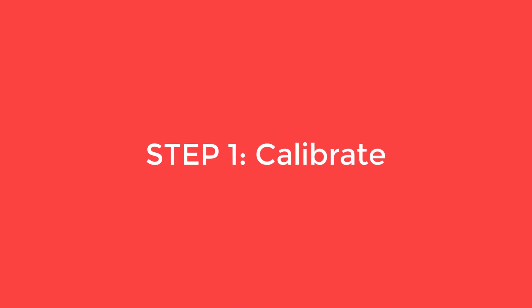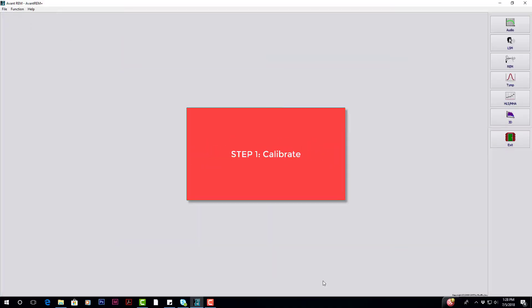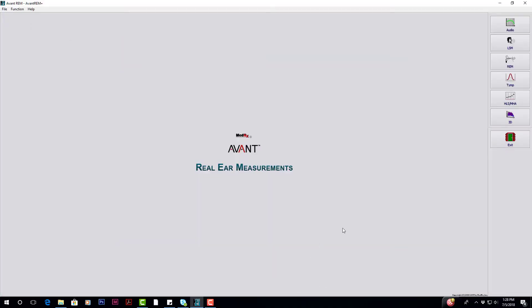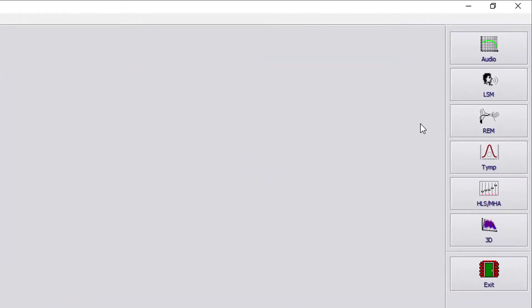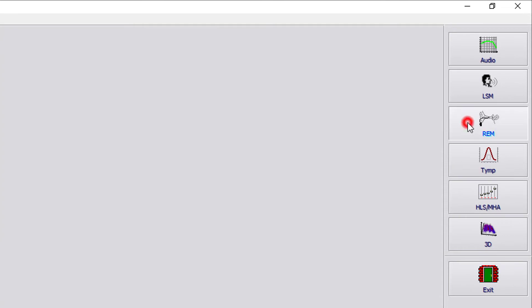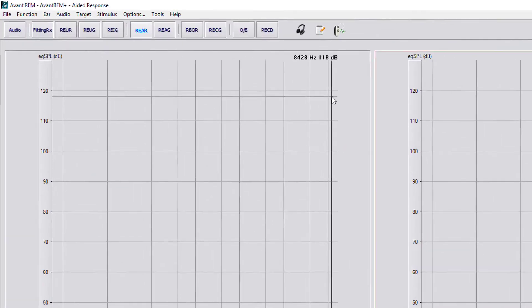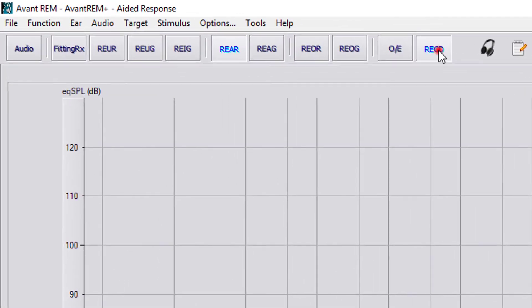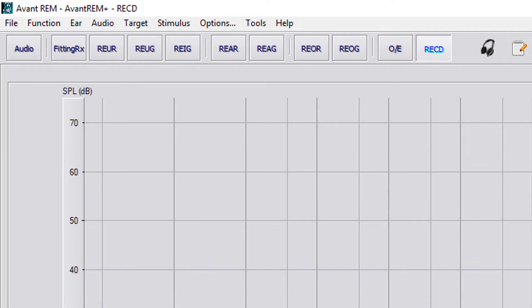The first step is to calibrate. In the REM software, select REM from the sidebar, then select RECD from the toolbar at the top.